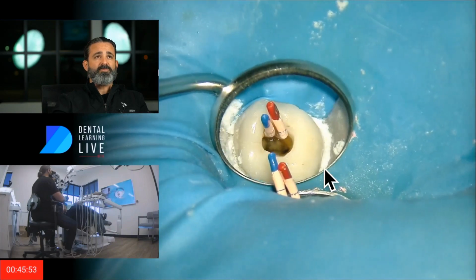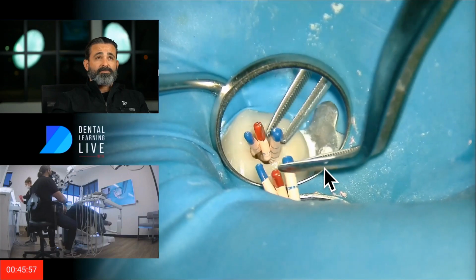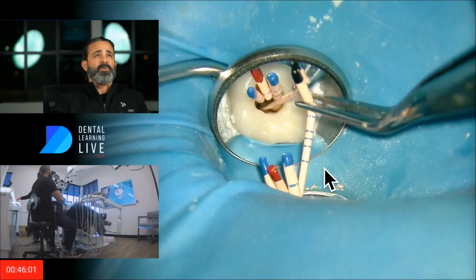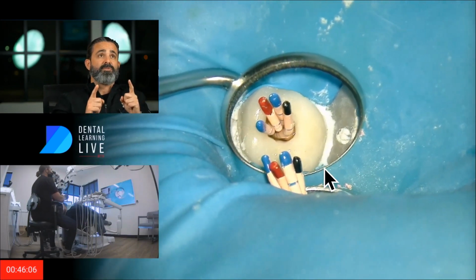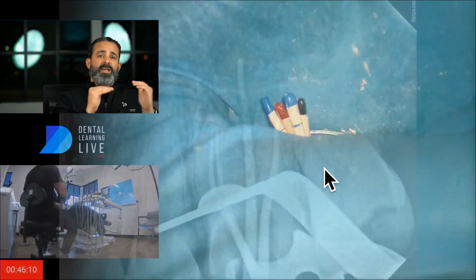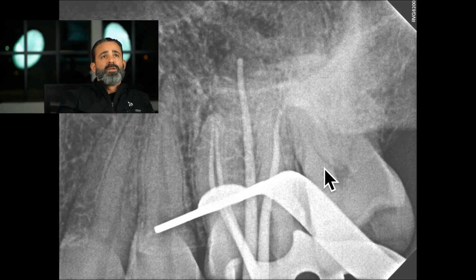And I'm gauging my cones. I'm guesstimating and placing my cones, and they're calibrated, and the advantage of that in these greater tapered canal shapes previously existing, I don't recommend it the first time, but this is a retreatment. I use those because then I can gauge where I'm at and make sure I'm not going long or that I haven't instrumented long. And I was successful with the GentleWave, so I know I didn't instrument long, but you can see where I'm at all along in each root.